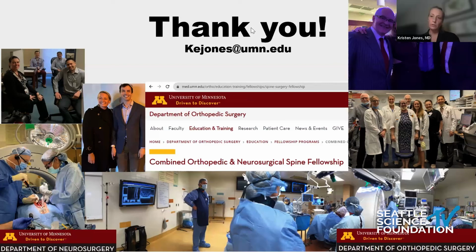So typically, one similarity to what Alekos had demonstrated was that he'll do sort of a subcrestal insertion technique for his iliac screws when he's using multiple iliac screws, and we will do that as well. Of course, you don't want the prominence of traditional iliac starting points. The S2AI, I just think it's important. It's really hard if you don't ask someone about the nuances of rod placement. You can end up with a mess at the end of surgery, even if you get the extra points of pelvic fixation. And so I think the tips about where to put them to line up your rods for optimal placement if you need to put multiple rods in are important.